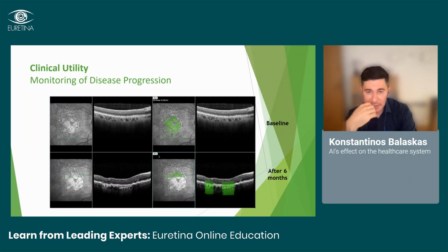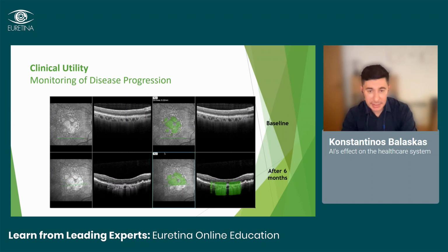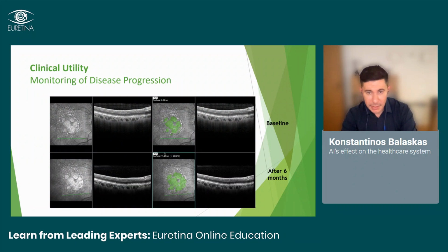And then 6 months later, let's say, we apply the same model, we quantify the area of atrophy, and we can see how much it has grown. Here, it's a case without treatment, and we can have a percentage of change. You can see here the percentage is 38%, so this lesion grew very significantly.